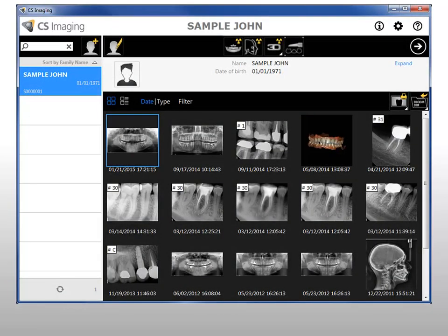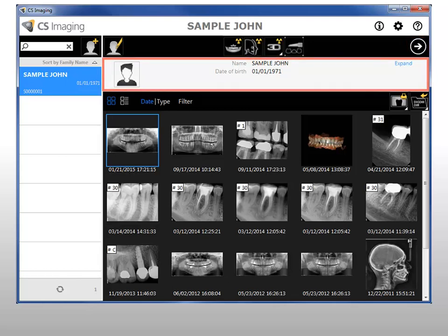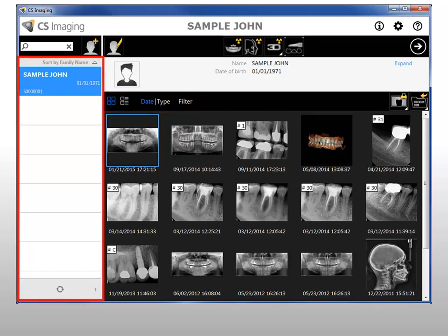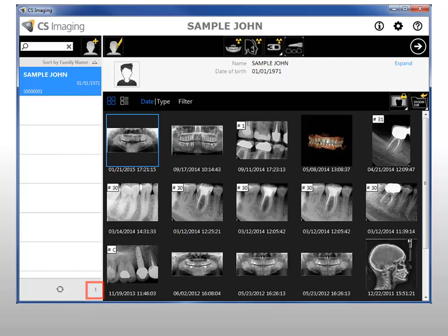The patient browser workspace contains the name of the selected patient, Launch Imaging software button, patient card, image management tools, patient history, patient history tools, patient list, patient search, patient management tools, patient count, and refresh the patient list.